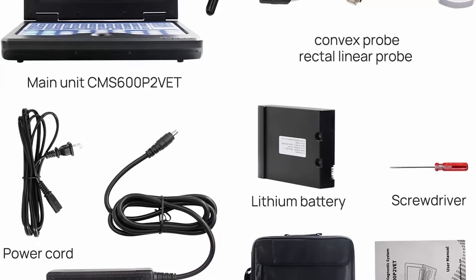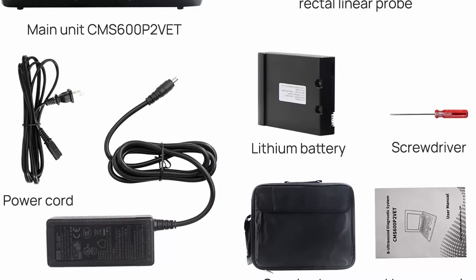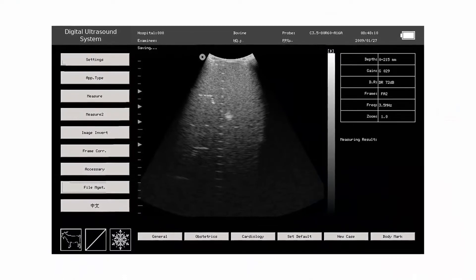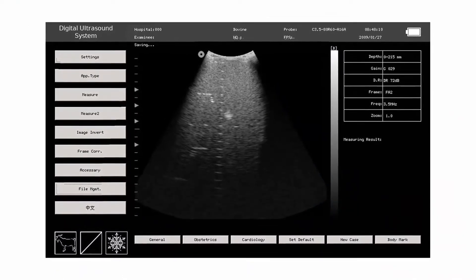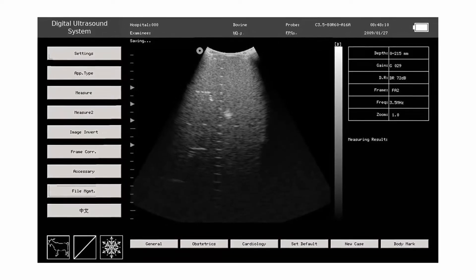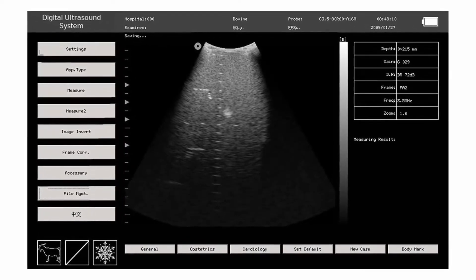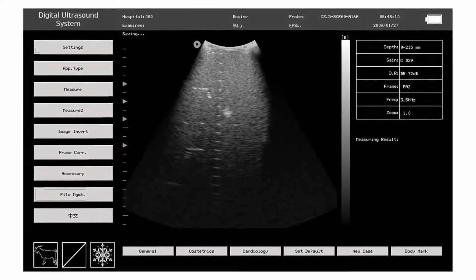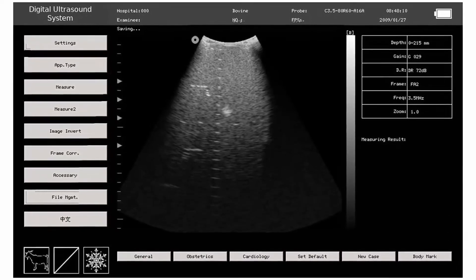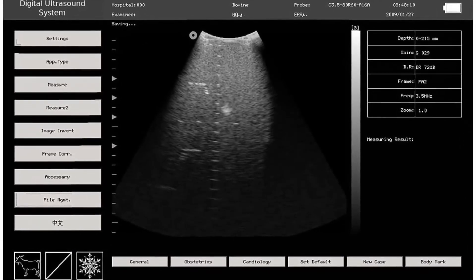The Contec CMS600P2VET is a veterinary ultrasound scanner for animal use with simple and easy image management. It features a 10.1-inch TFT LCD screen with display modes B, 2B, 4B, BM, and M. Its portable design is small and lightweight for mobile use. The lithium battery can work continuously for up to two hours after fully charged.